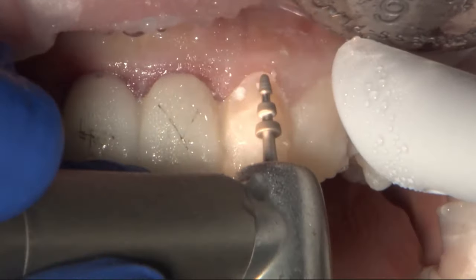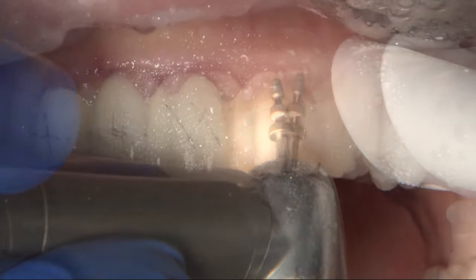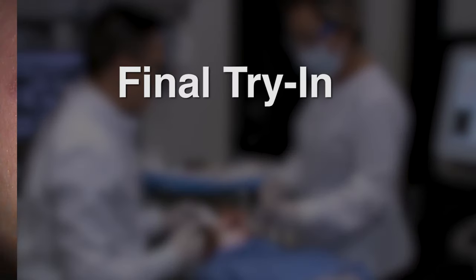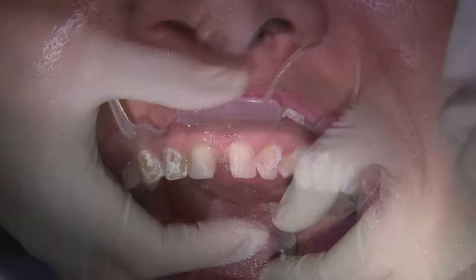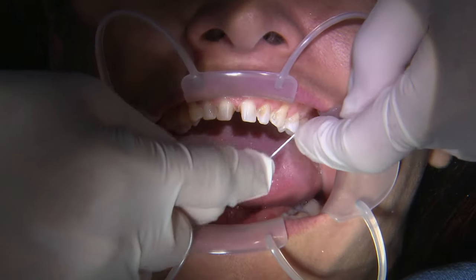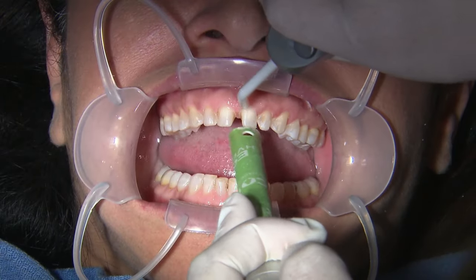There are depth cut burs that look like a Christmas tree, with different thicknesses and depths that you can create, and they go across horizontally. Now, where you do have to cut off the temporaries depending on how locked on they are, and any areas where there's resin residue, I like using a slow-speed carbide round bur to take that off.